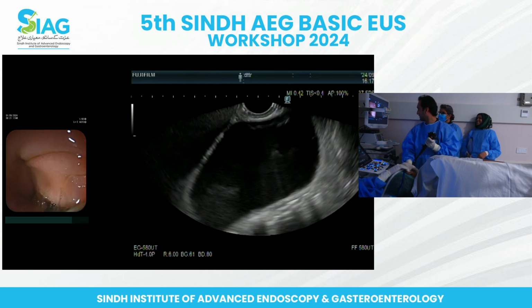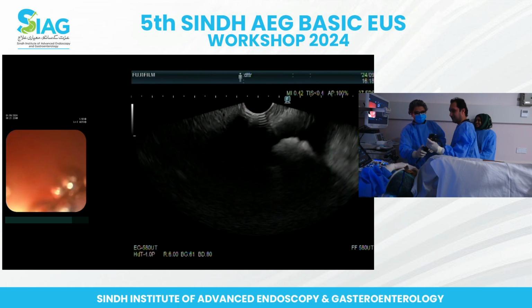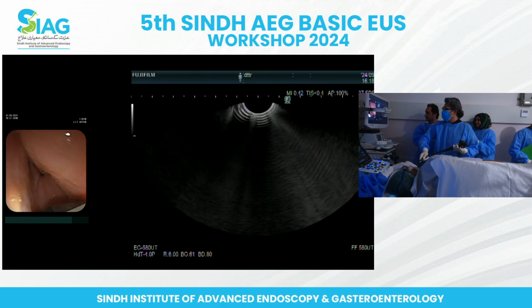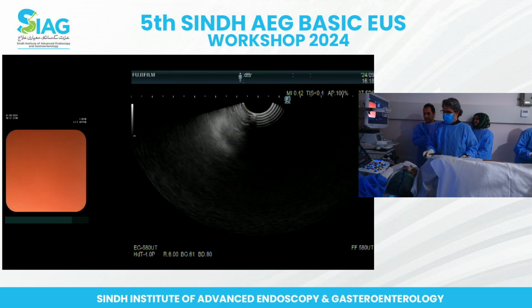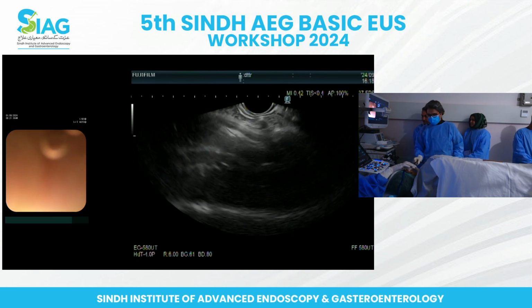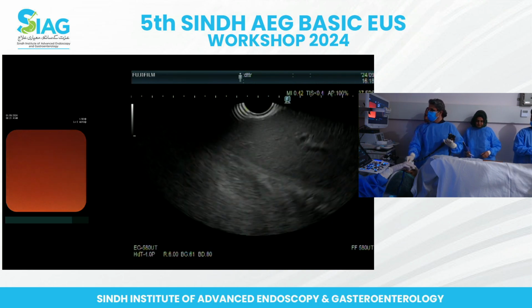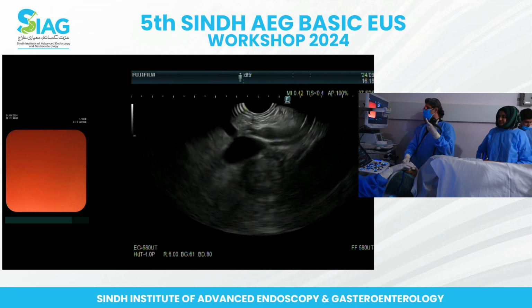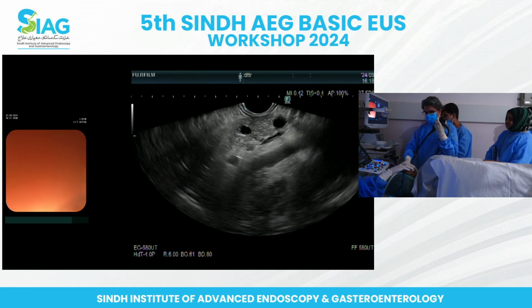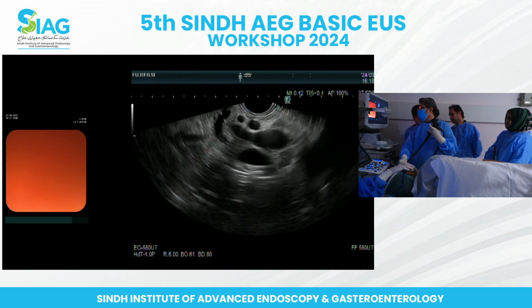Unable to trace the CVD. Right, let me have a look. Let's see what this is. Is it locked? It's all on. Let's just start from the. Middle, 22 gauge. Yep.